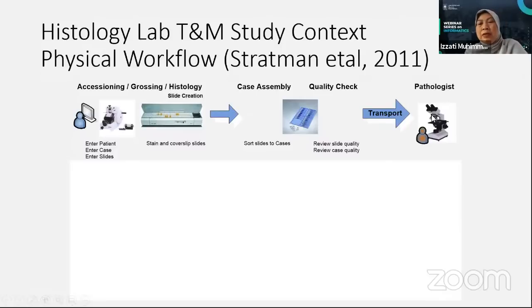Then the pathologist or the laboratory worker will read the slide under the microscope. That's the workflow in manual microscopic reading.